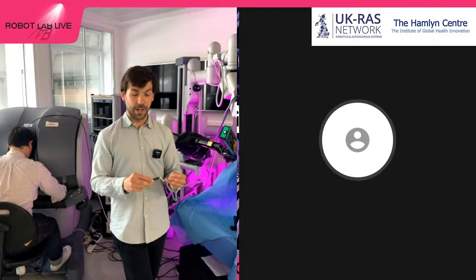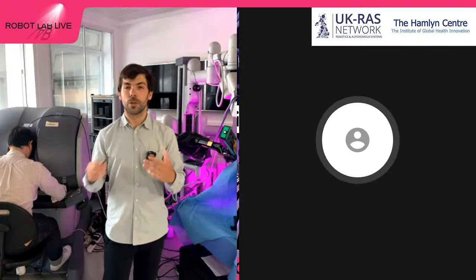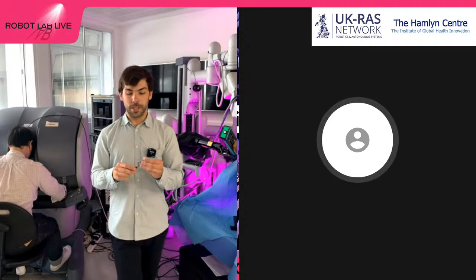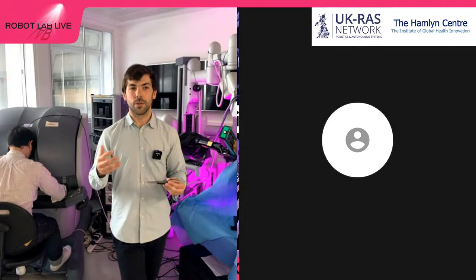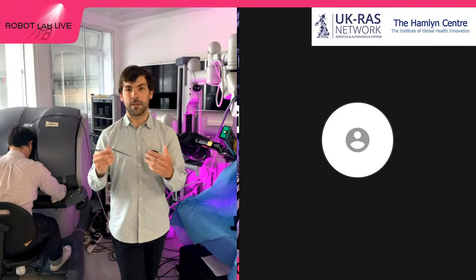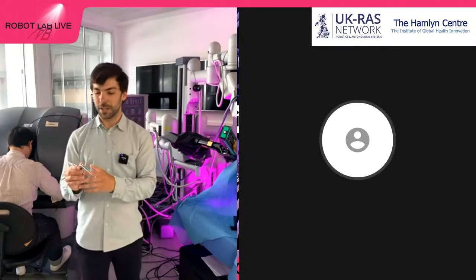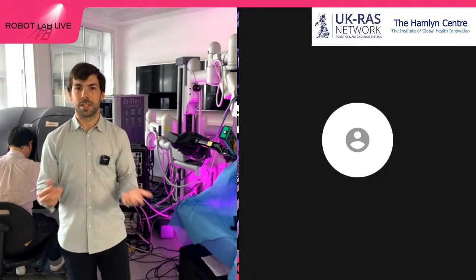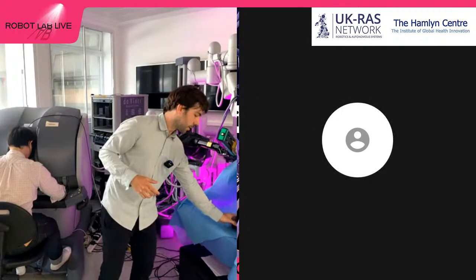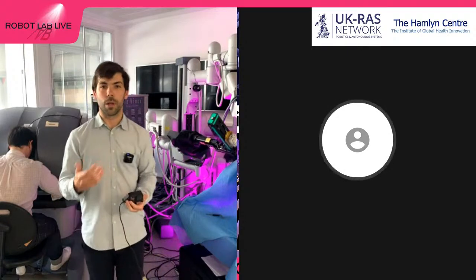force. An example that excites me much more than this is when we cannot perceive the force that we apply and it is dangerous for the patient, right? In this case, we can use mechatronic devices to magnify and amplify the force that the surgeon applies and thus feel it. It's kind of like having some sort of superpowers, right? And enhance possibilities that as normal humans we cannot have. But yeah, I think that's enough speaking. We can go to the actual demonstration and show you how a real robot works.